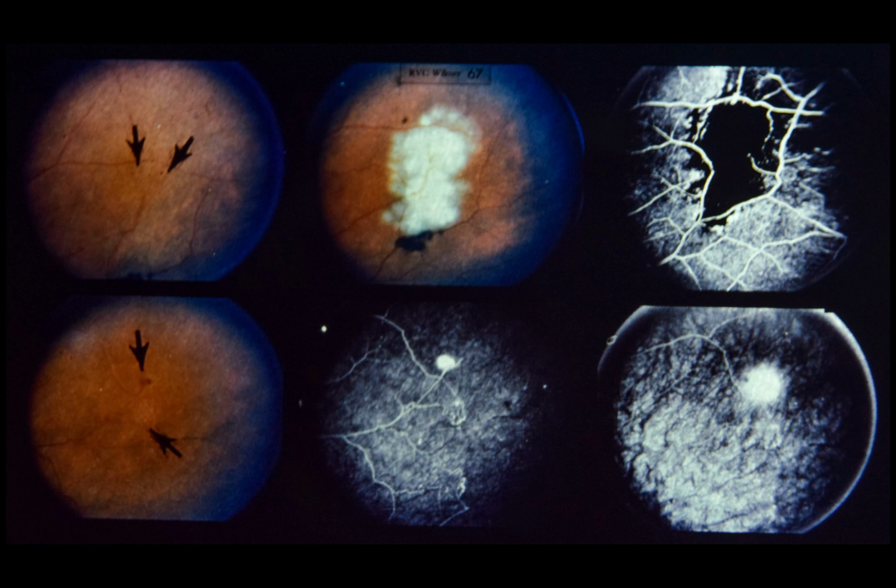Slide 67. Focal argon laser photocoagulation for proliferative retinopathy in Eales disease. This 42-year-old white male developed blurred vision in the right eye while playing tennis. Examination revealed vitreous hemorrhage in the right eye and several areas of surface retinal neovascularization and peripheral retinal non-perfusion in both eyes. The source of vitreous hemorrhage in the temporal periphery of the right eye could not be determined at the time of initial examination.